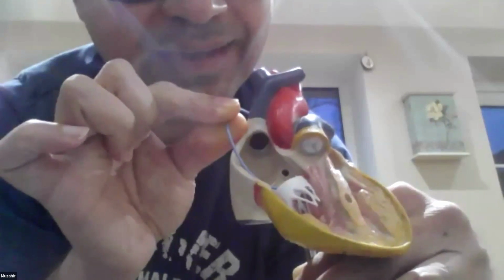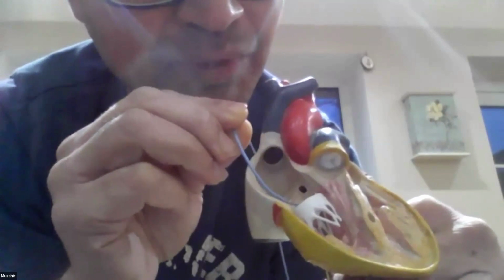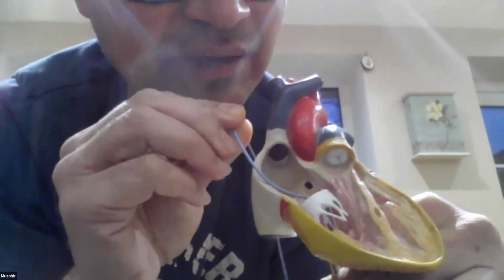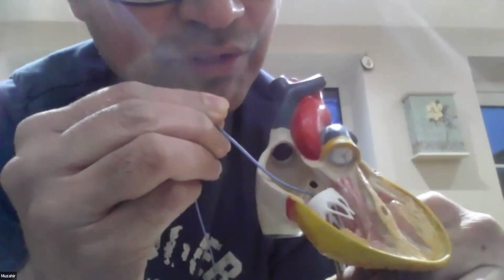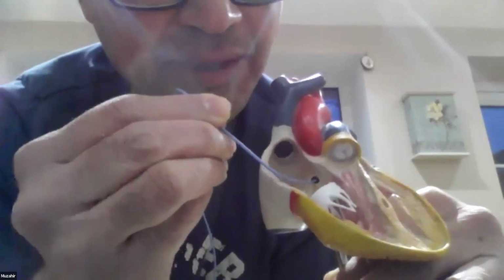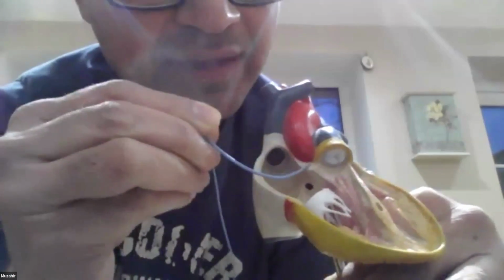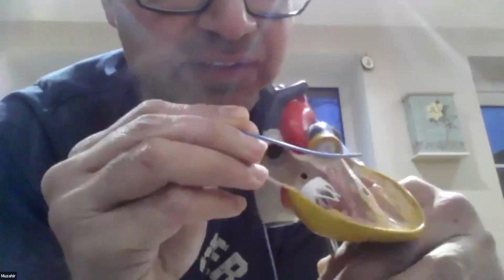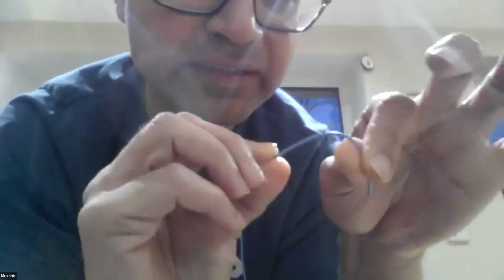The technique, which Hasham has described, is a gentle pulling back and a counterclockwise rotation. Pulling back, counterclockwise rotation should get you into the os of the coronary sinus. If there is a valve, it may get stuck, but in general, if you persevere a little bit, it will fly across. Because of the rigidity of this catheter and because of the fact that it can flex, the ones that are deflectable, it gives you this additional support and torqueability to get in.